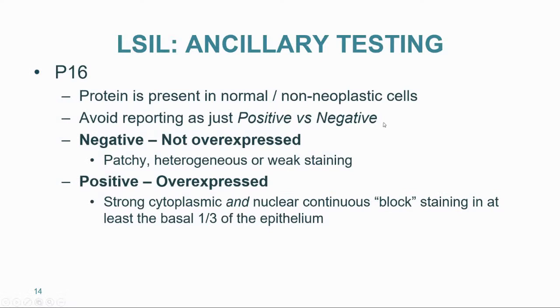We're going to talk about p16 and other ancillary tests throughout the talk, but I'm going to start with p16 at this point because it's relevant to LSIL, believe it or not. The first thing I want to say about p16 is I try to avoid reporting it as just positive or negative because people may not understand what you mean by negative or by positive.